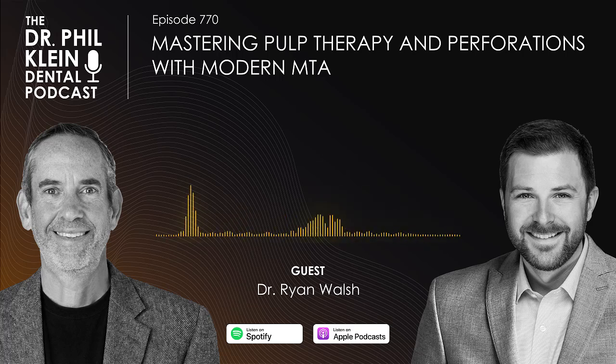The faster you can get that repair, the more predictable. Right. So you mix that up, and it's a pretty stiff mixture, right? It's not like soup. You want it to be a little pasty, right? Yeah, exactly. I say wet sand, something that's kind of packable. Everybody kind of has their own little niche.